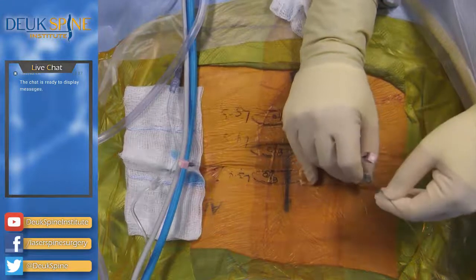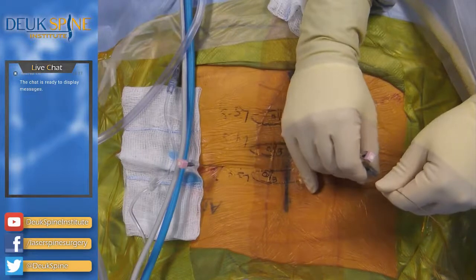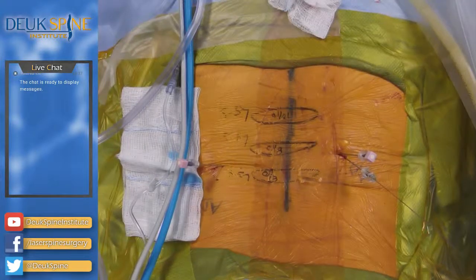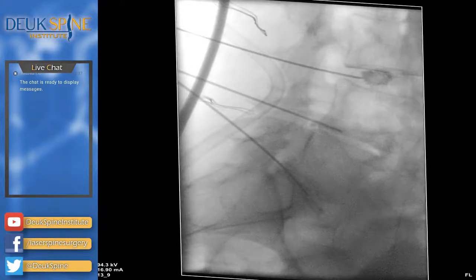All right. Here we go. We're going to take this needle out and leave the guide wire. Are you awake? So I'm going to need some help getting in. Shot? I need the lights down. This one on, so I can see. That's good. Oh no, that's bad. Yes, yes, yes. Thank you. There we go. So we're leaving the guide wire in the L5S1 disc space, and we're pulling the needle out. Needle's out. So you can see the guide wire is still there.